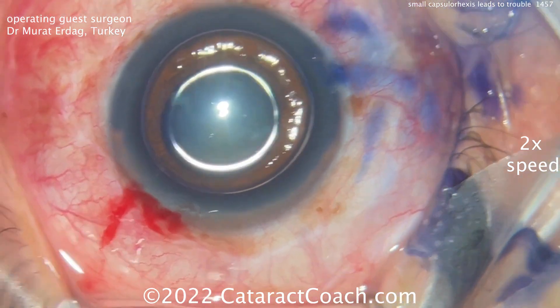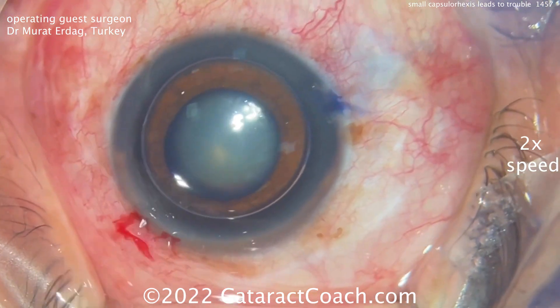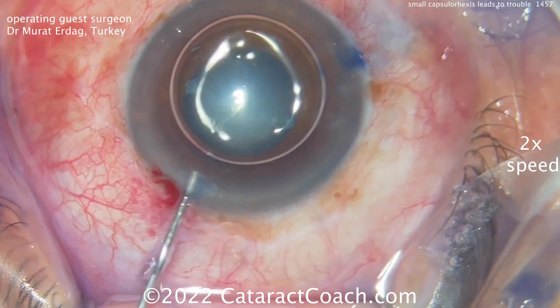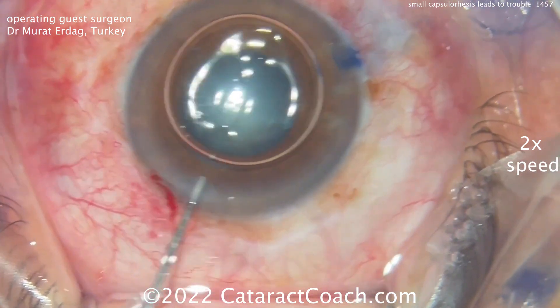There's a little air bubble and some TriPan Blue dye, which can be helpful as well. Now washing that out and getting the viscoelastic in — let's get this thing going.